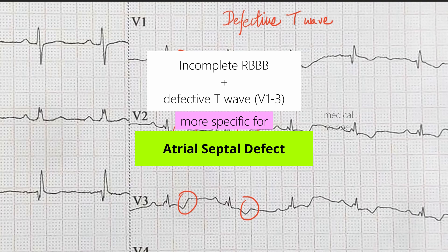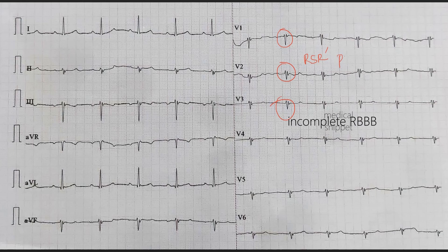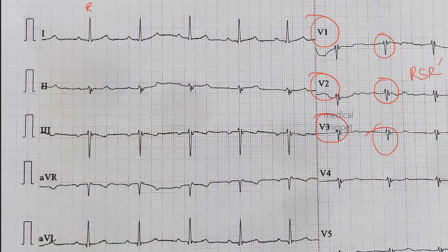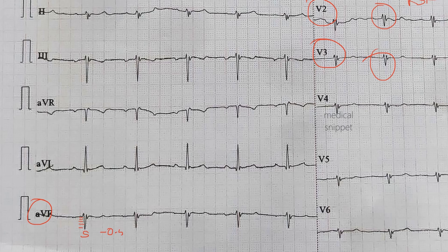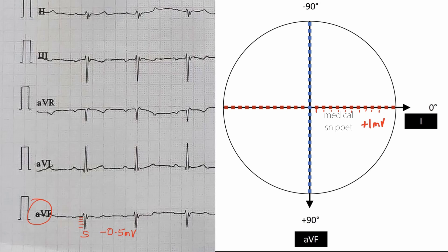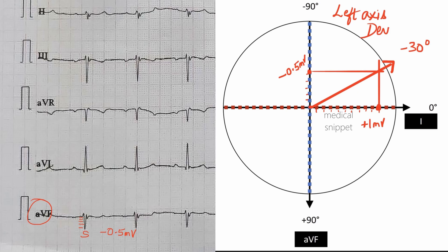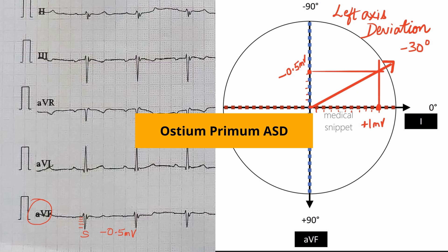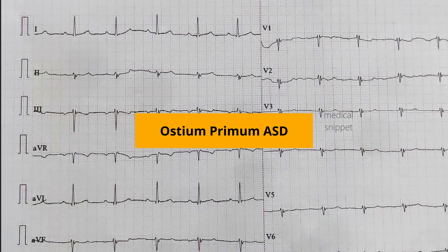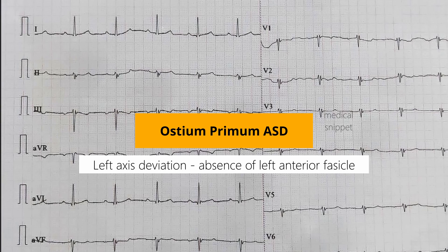Let's look at another ECG. There is incomplete right bundle branch block — that is RSR pattern in V1 to V3 — but let's calculate the QRS axis. The QRS amplitude is positive in lead 1 but negative in AVF, so there is left axis deviation. This leads to the diagnosis of ostium primum atrial septal defect. In ostium primum ASD there is left axis deviation due to the absence of the left anterior fascicle. The left axis deviation persists even after closure of the defect.